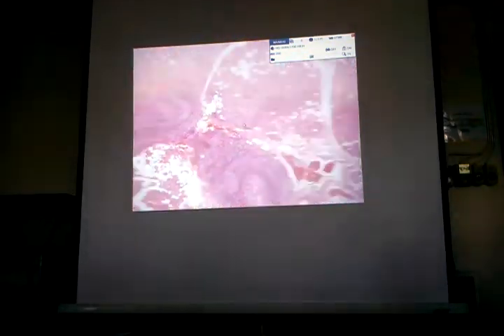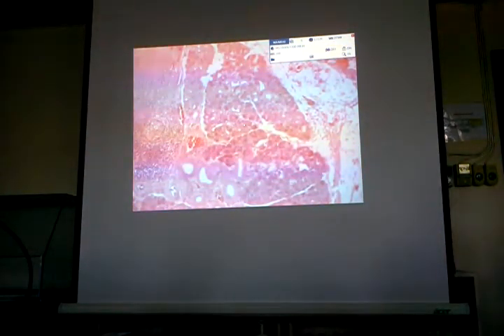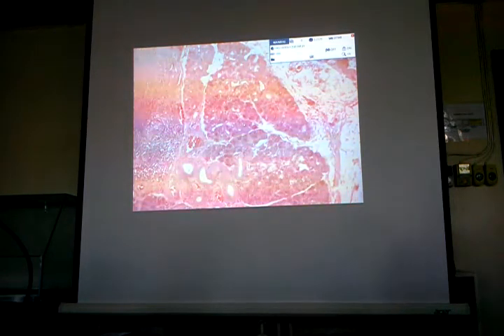And then our last slide for the head and neck portion is chronic sialadenitis. Okay, we will again begin with the normal histology of the parotid gland. So how do you call those pointed structures? Acini. And then this one group of acini is called?